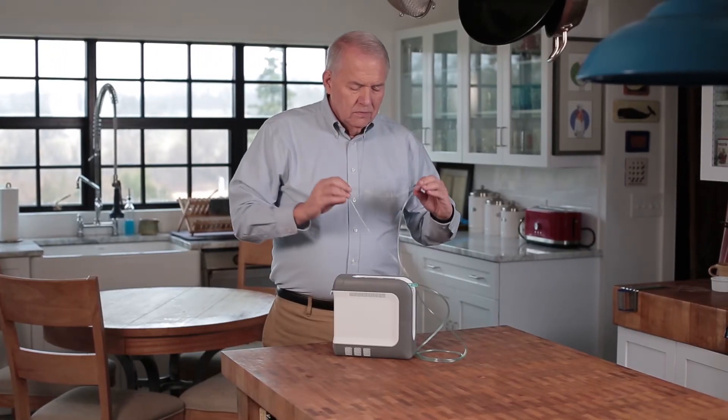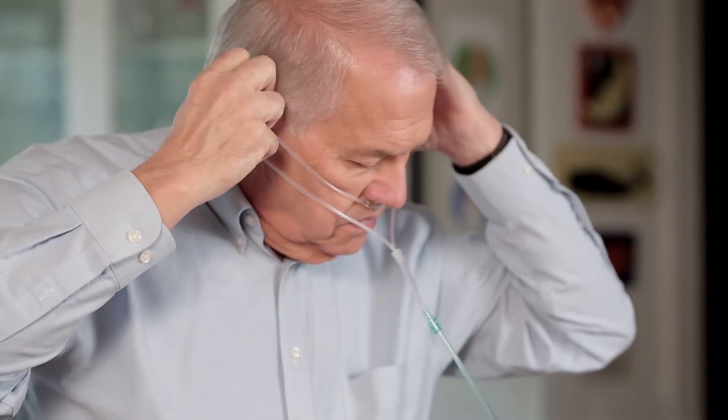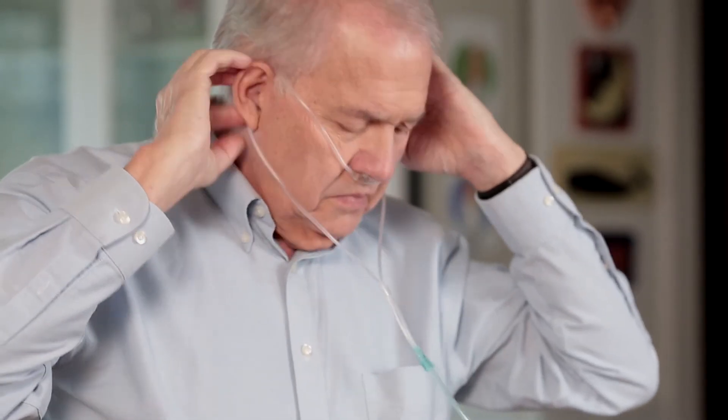Properly position the cannula with the nasal prongs facing upward and insert the prongs into the nose. Wrap the cannula tubing over the ears and position in front of the body.